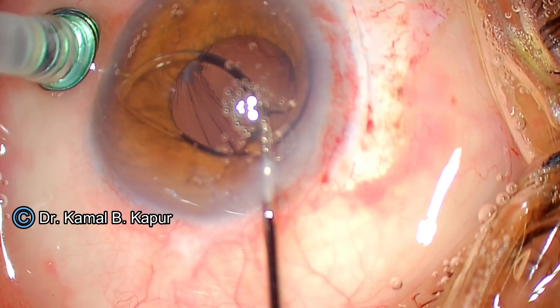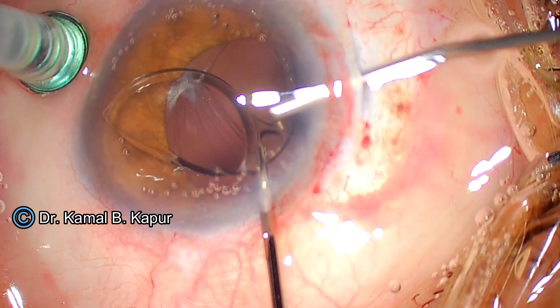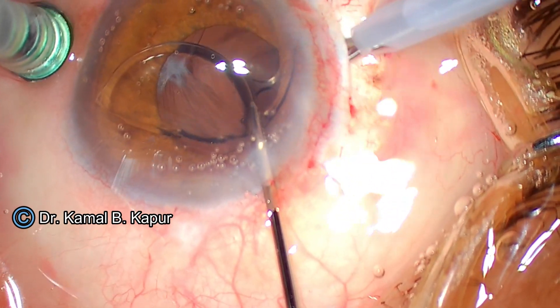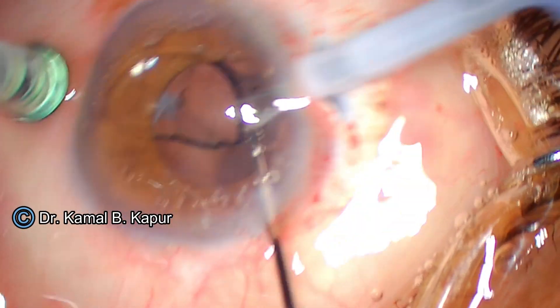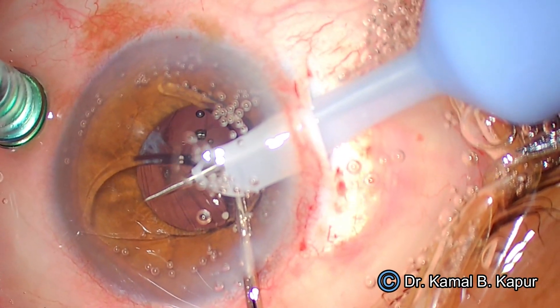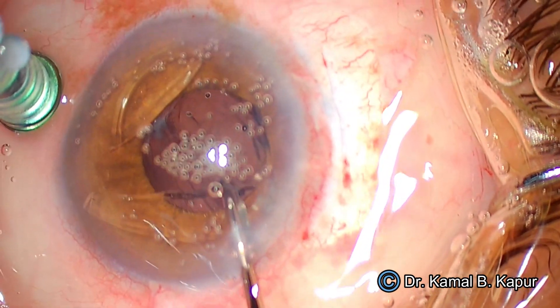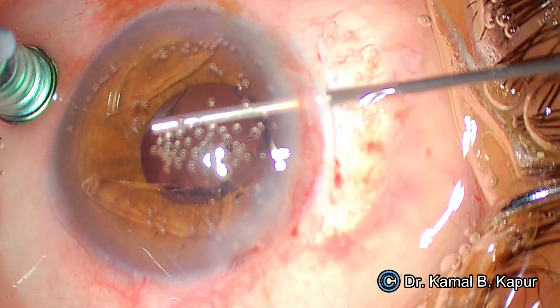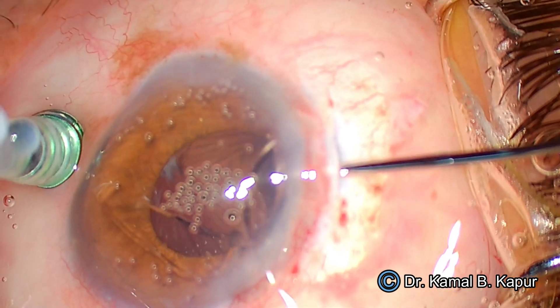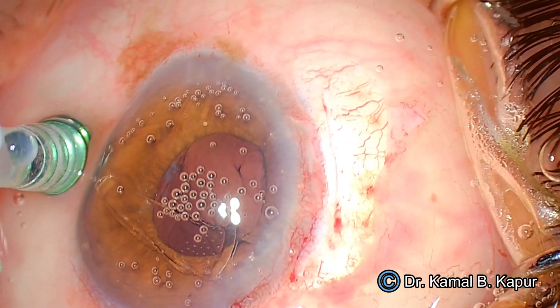Once we have a good grip at the haptic-optic junction, we switch on the fluid from the infusion port. Then we start using phaco power — the settings for this case are 55 to 60. The phaco power here generates only mechanical cutting; there is no ultrasound used. It's only mechanical to-and-fro movements. The trick is not to have too much fluid coming in — otherwise the iris will start prolapsing — but also not to have hypotony, otherwise the IOL pieces may drop down. My OT technician is coordinating the inflow and outflow carefully.